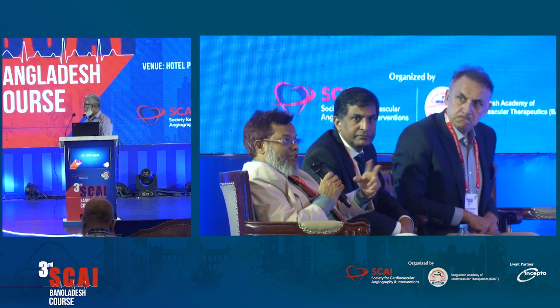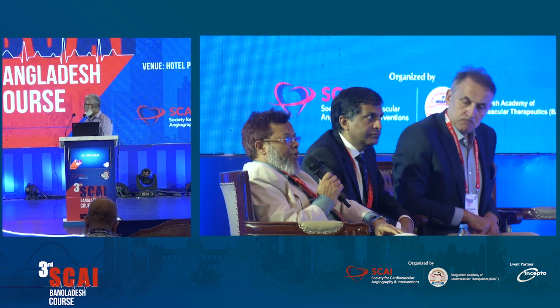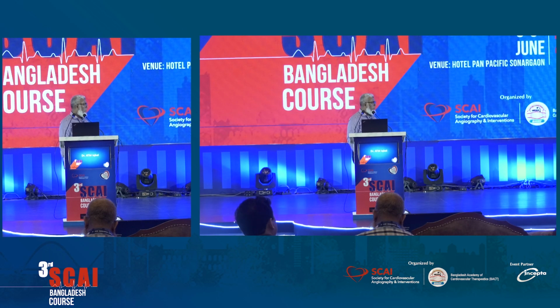And here kissing is also in step, kiss and then pot. Yes, but you have shown it very nicely. Thank you. That is a very good alternative, but stent, then put a stent in the LAD, recross and do that. But whatever the technique you use, ultimately the final result is the answer. If it is good with long-term outcome, that is good.